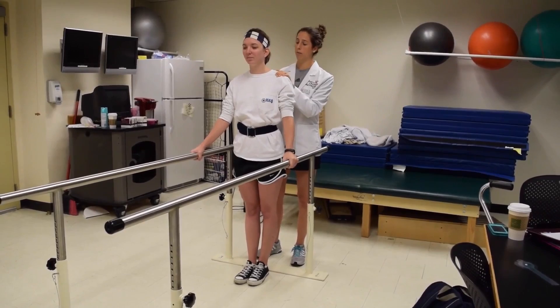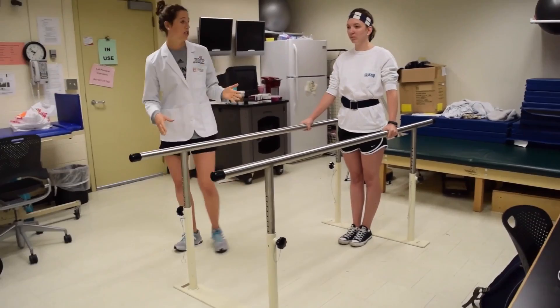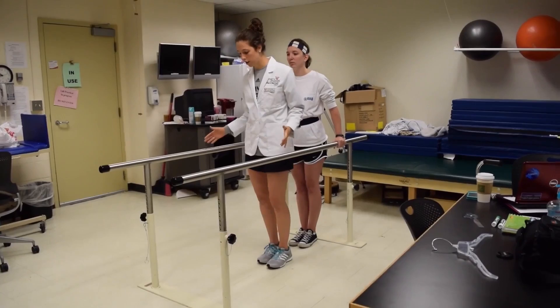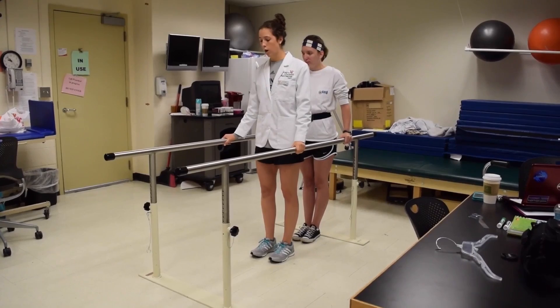Do you feel firmly okay if I let go of the gait belt? The next thing we're going to do is just practice a very simple gait pattern. I'm going to demonstrate this to Courtney before she does it so she can actually watch me. We're not going to practice specific gait patterns at this time, but I want to just get her used to some movement with her arms and legs using the parallel bars.